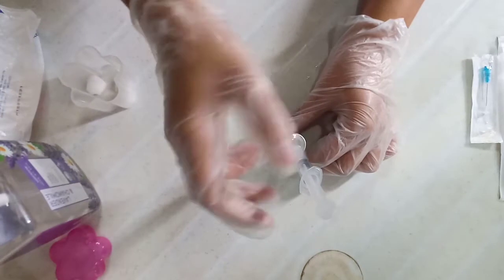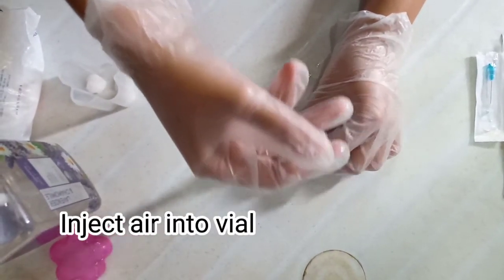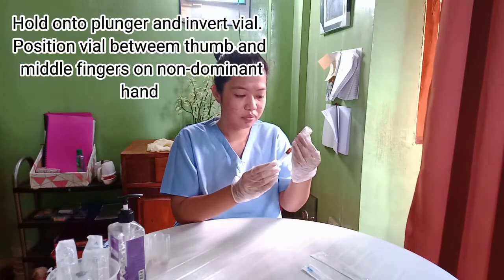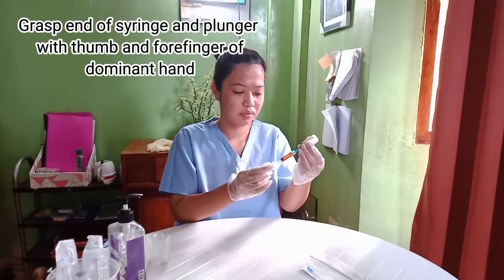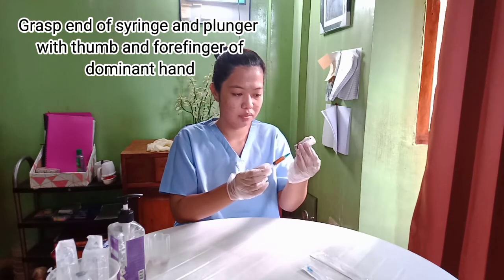Put on the needle and insert the tip of the needle through the surface of the rubber seal. Inject air into the vial. Hold onto the plunger and invert the vial, positioning it between the thumb and middle fingers of the non-dominant hand. Grasp the end of the syringe and plunger with the thumb and forefinger of the dominant hand.